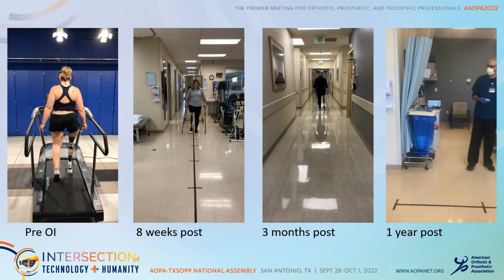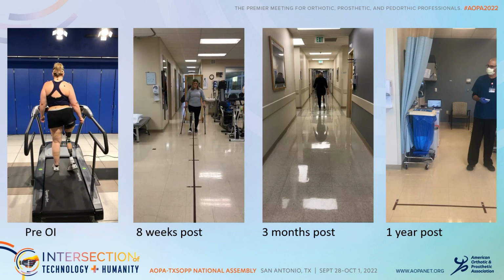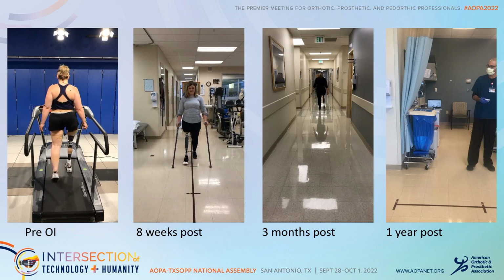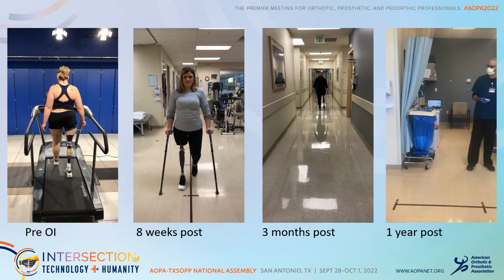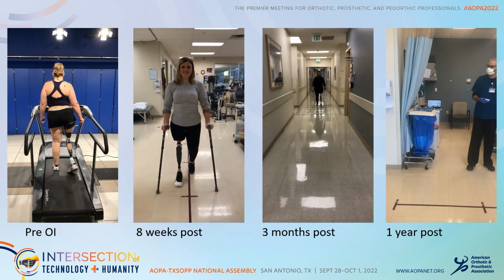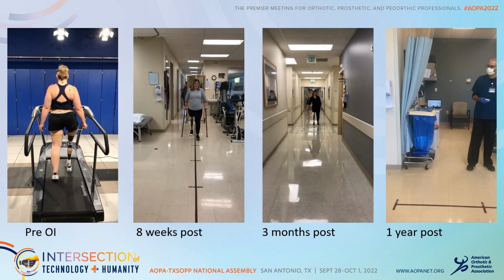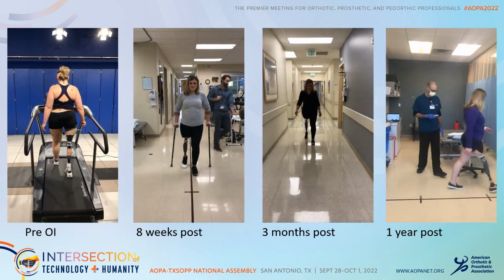So here's an example of a patient pre-OI. You can see a pretty abnormal gait pattern, and this is a press fit patient, and the slow progression. It's very critical that we monitor their physical therapy closely so that we start balancing and retraining their gait, with the goal of ultimately having them walk normally.